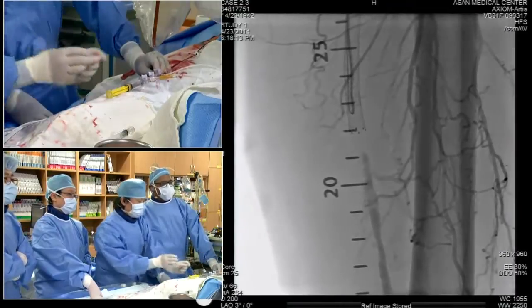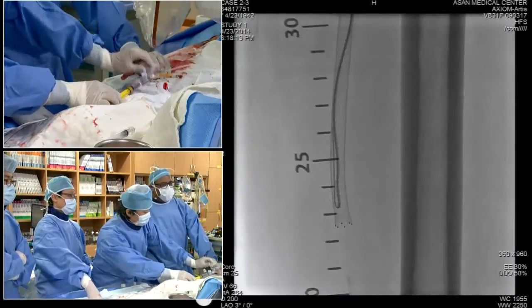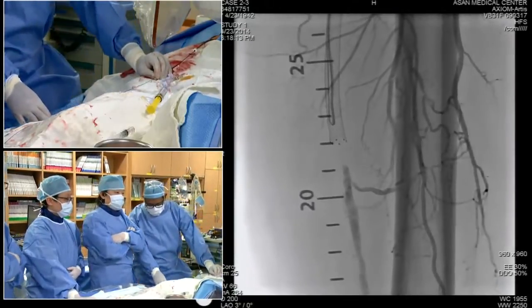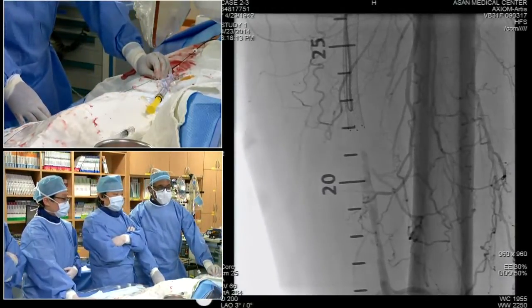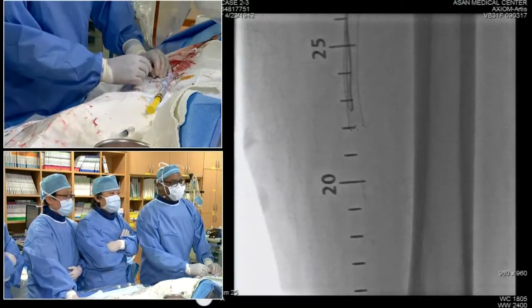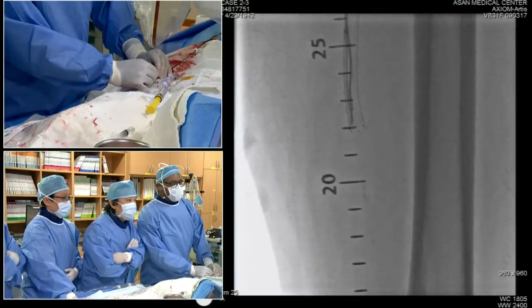to be the crucial point, because I can tell you doing a reentry catheter alongside a nitinol stent becomes very problematic, in part because it's over a 14 wire. So let's see what good graces we have here in trying to re-enter this.